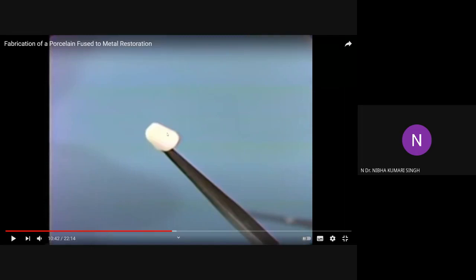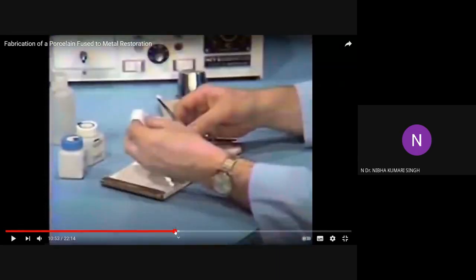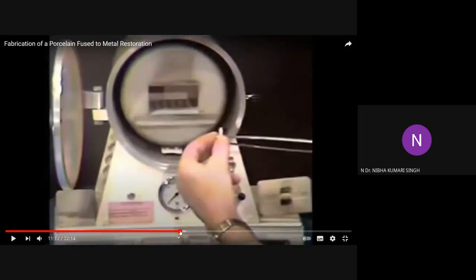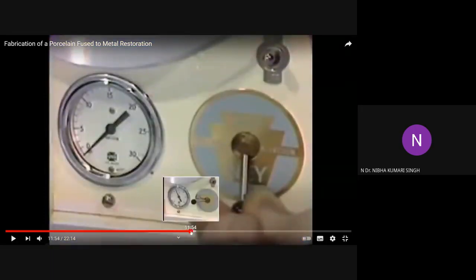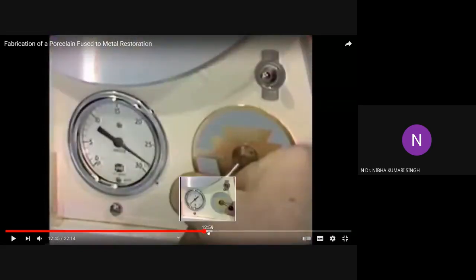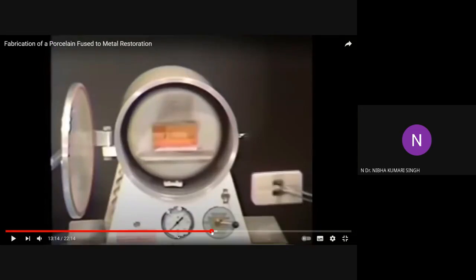Then you can see this is the body or dentin porcelain. Body or dentin porcelain are one and the same, and form the bulk of the ceramic crown. After it is applied, it is subjected to the firing or sintering procedure in the furnace. This is a horizontal type of furnace, which was available in olden days. Nowadays vertical furnaces are available. Next you can see they have been placed in the furnace. Then incisal porcelain is applied. These are all oxidation cycles, different types of cycles he is showing.